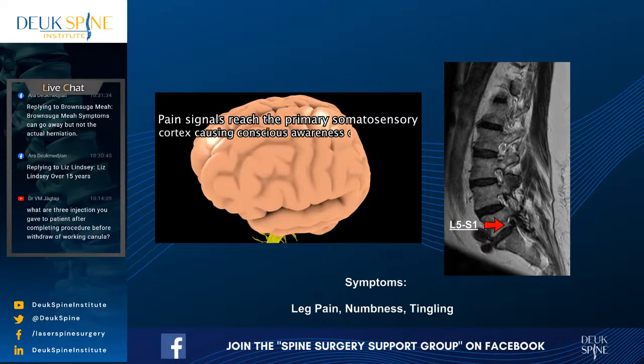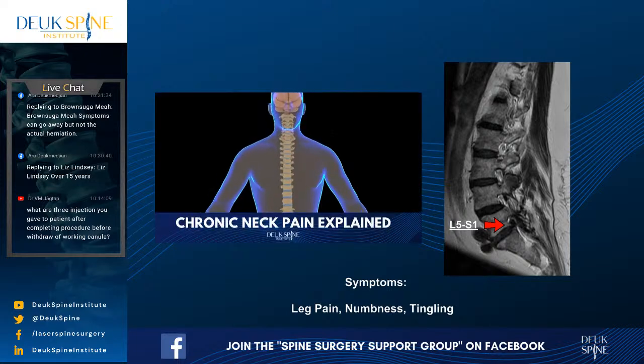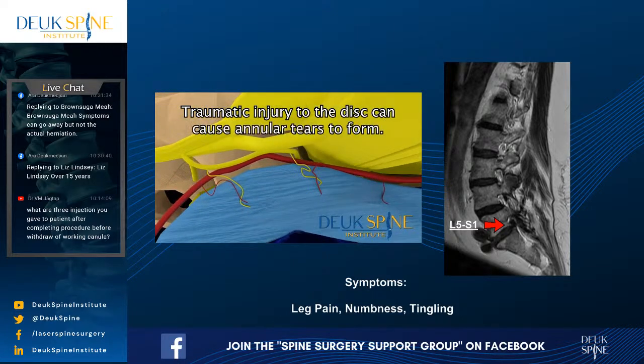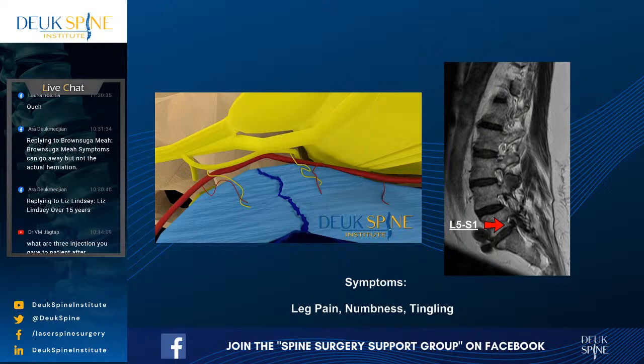All right, Dr. Deuk here. We're going to get started, okay? If you have pain, I want you to say ouch, but don't move your body around. We have straps on? Okay. Are you comfortable? You're going to be awake for the first 10 minutes, and then we're going to put you to sleep, okay? Before we get started with the surgery. And if you feel pain, you can say ouch, and I'll give you some more numbing medicine.